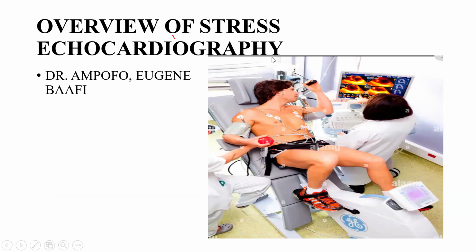Okay, so you look at this picture to start with that last one. You see how the bicycle is. If you look at the picture on the first slide, you have all your electrodes connected to the patient, your BP cuff, someone is checking the BP, and the cardiologist or echocardiographer is doing the echo. Do you appreciate it? So yeah, it's possible. I can see it. You see it now, yes.